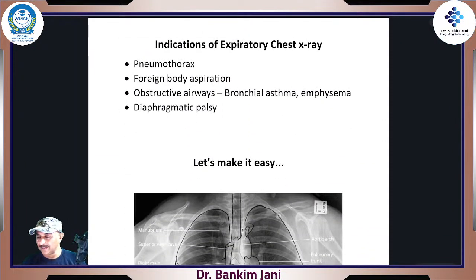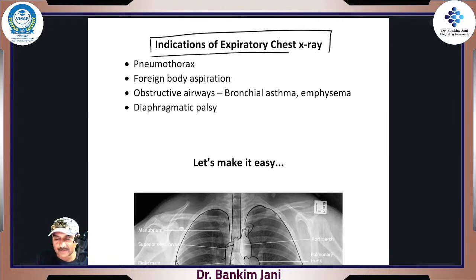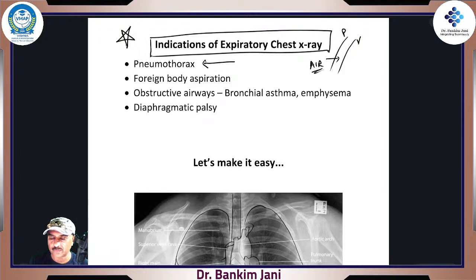Is there any condition in which you deliberately take X-rays in the expiratory phase? Put a star. Pneumothorax, right? Now, this pneumothorax is a pathology. You know this part, that pneumothorax means air has entered the space between the parietal pleura and the visceral pleura, the interpleural space, where there is only fluid. If the air enters into it, you call it pneumothorax.